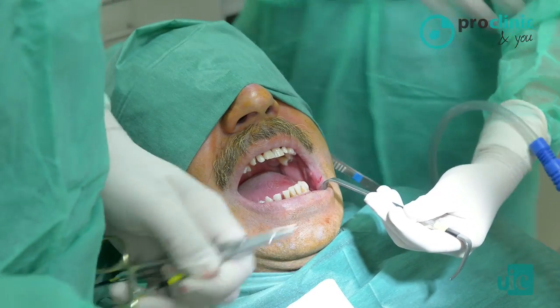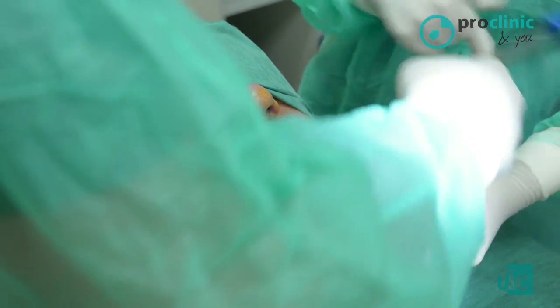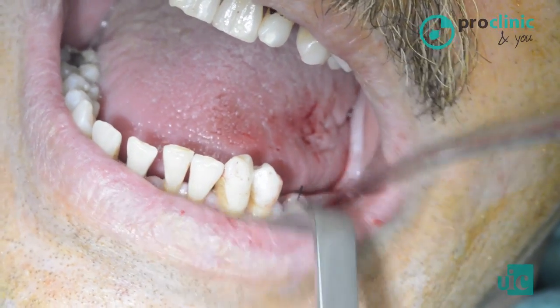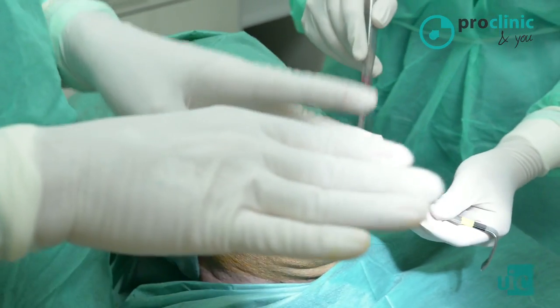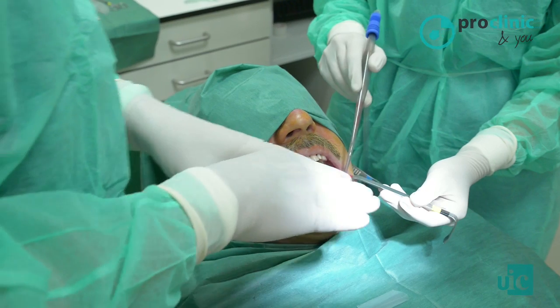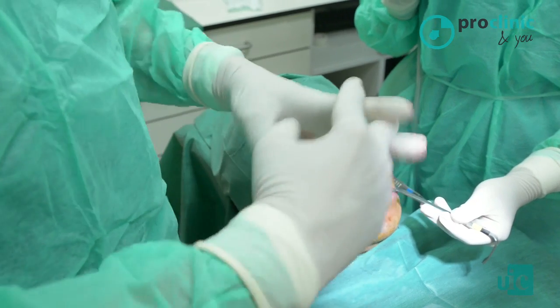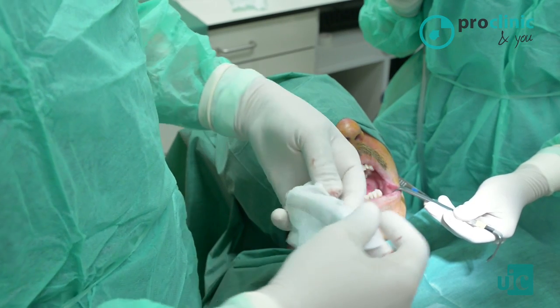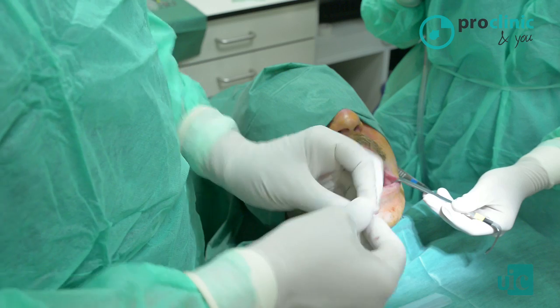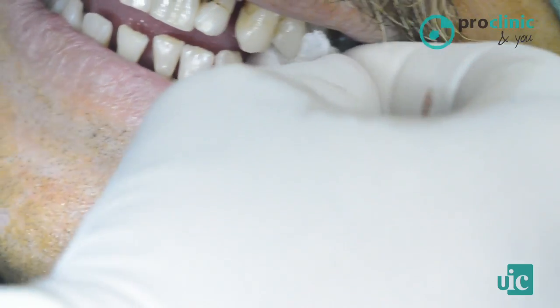At the beginning, we have just finished. Now the extraction is finished, and we are going to clean, aspirate, and apply a little gauze to make compression on the area. The stitches approximate the edges of the wound and also serve as a retention for the blood clot, so that the clot stays in the alveolus and facilitates its good revitalization and re-ossification. What little was left. Now we place a dressing. We recommend you leave the gauze in place for about 20 minutes. The patient is now going home.